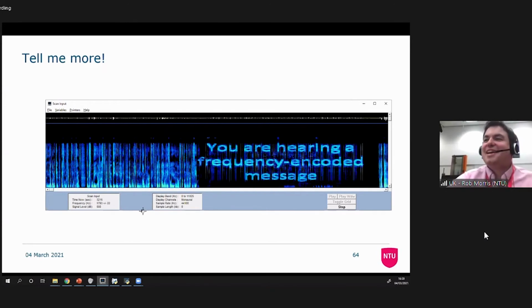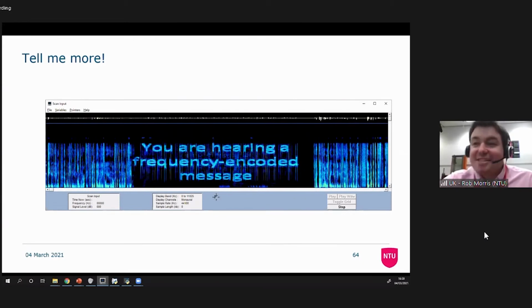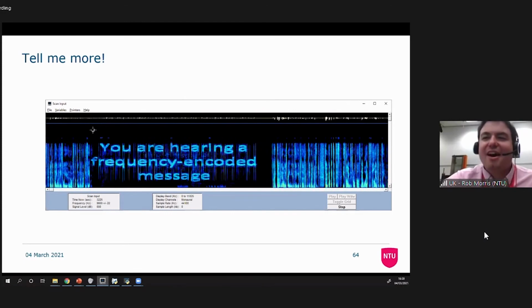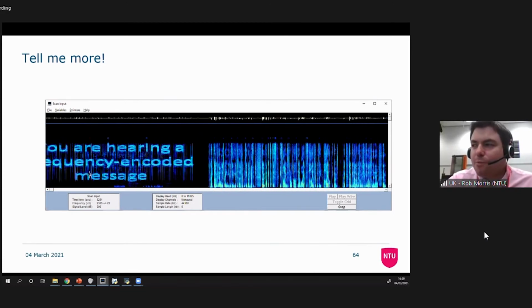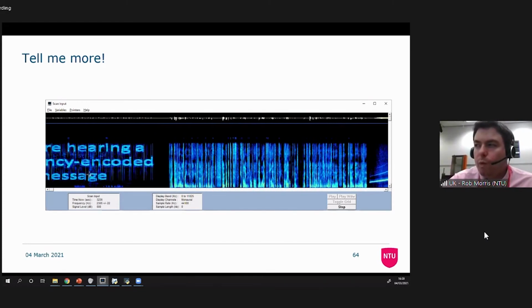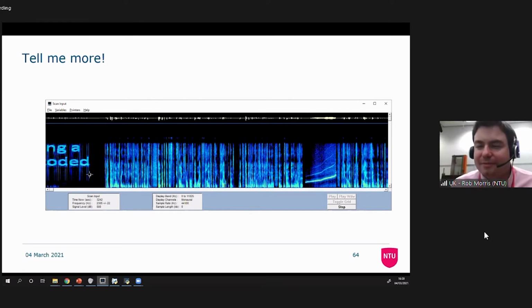Okay, so hopefully now on your screen, you can see that you've just heard a frequency encoded message. So our x-axis is time as it scrolls past, and our y-axis, the higher the frequency, the higher up it goes. Okay, so we can have a little bit of fun with this. You can see my voice on there now. We can do in real life, and you'll see that the higher the pitch of my whistle, the higher the sound will go on that display.